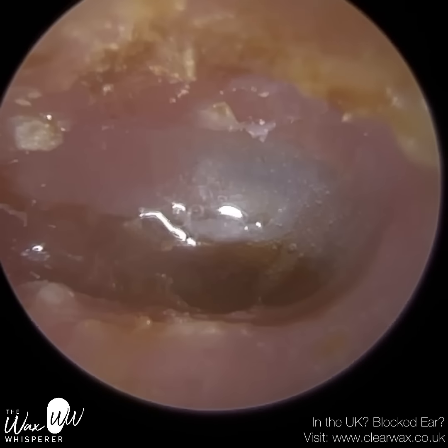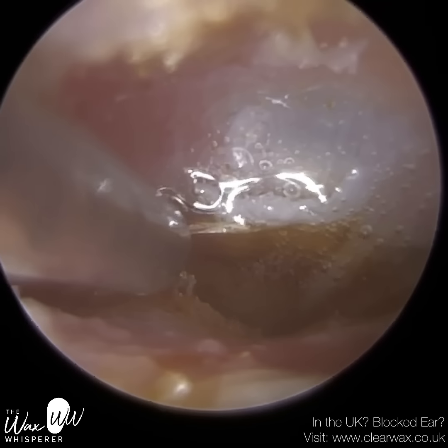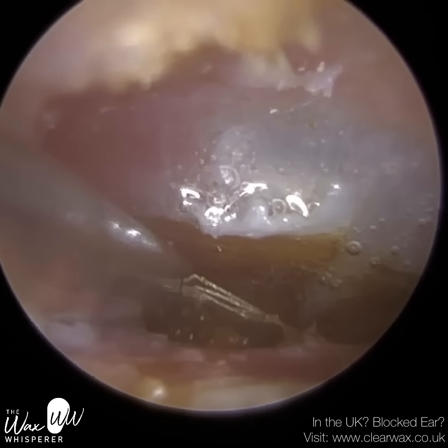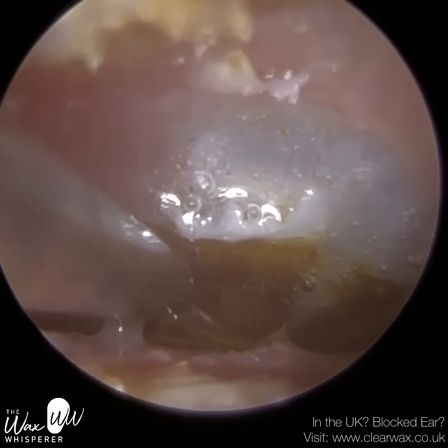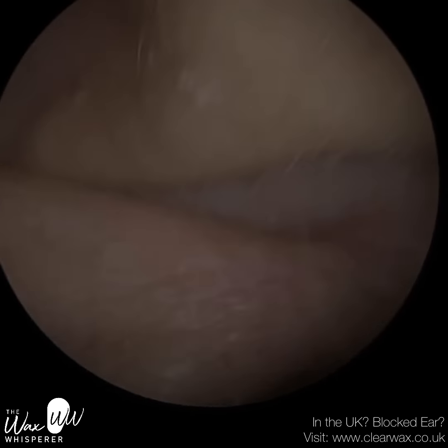Now, because the ear was infected, I wanted to avoid using drops if at all possible, but this skin is too strongly adhered. So I've just put a minimum amount of olive oil here. And I've really managed to get the endoscope as close as possible so I can really see what I'm doing, because it is a delicate procedure this.